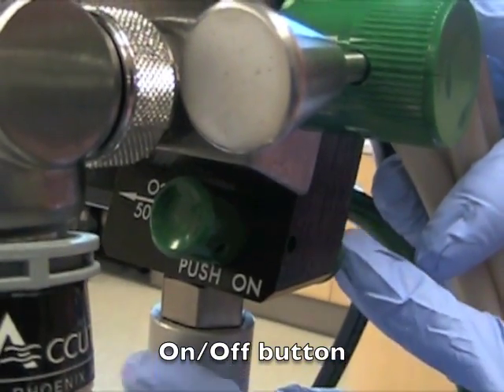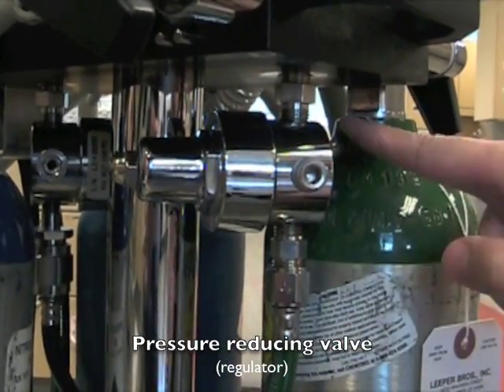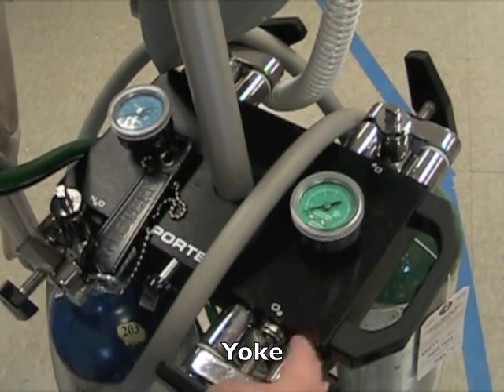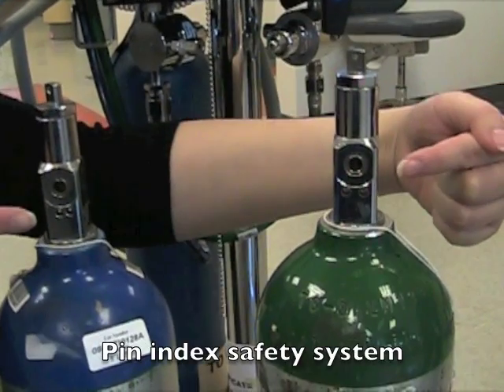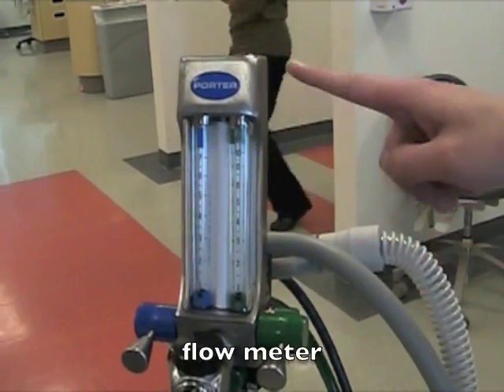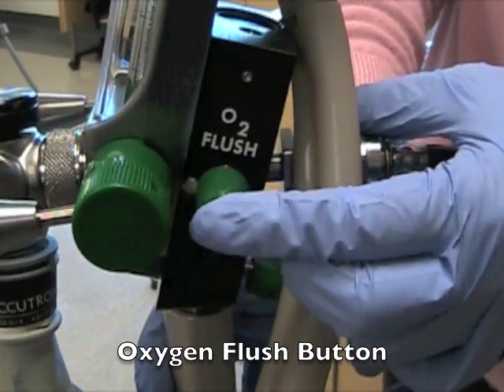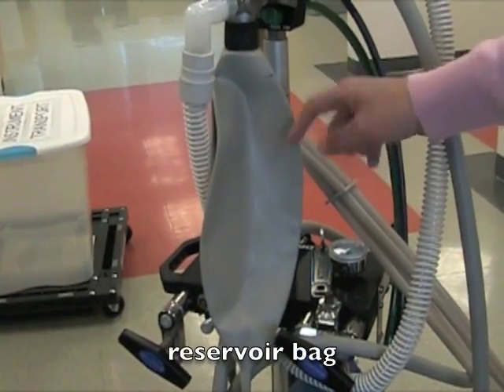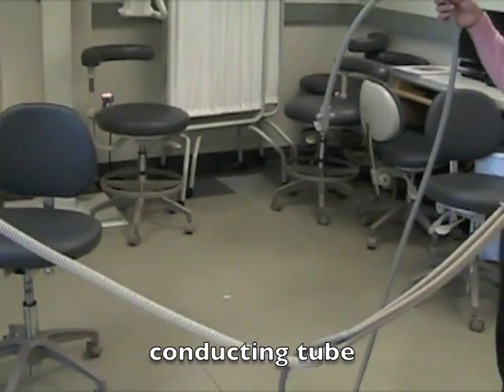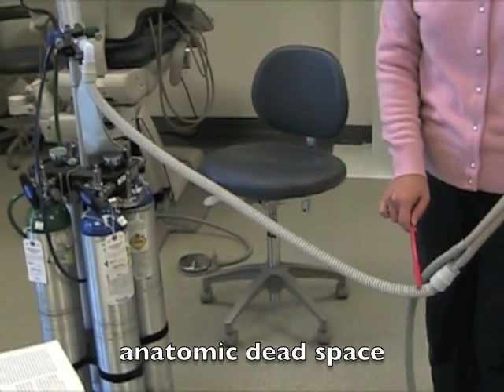This is the on and off button. This is the pressure reducing valve. This is the yoke. These are the pin index. This is the flow meter. This is the oxygen flush button. This is the reservoir bag. This is called the conducting tube. This section is called the anatomical dead space.